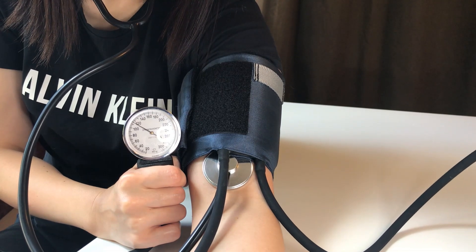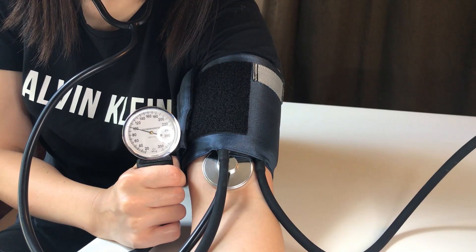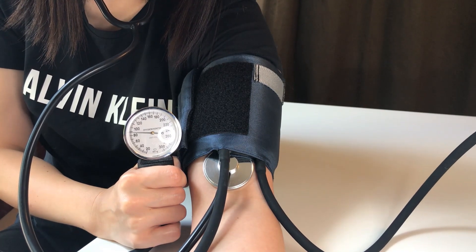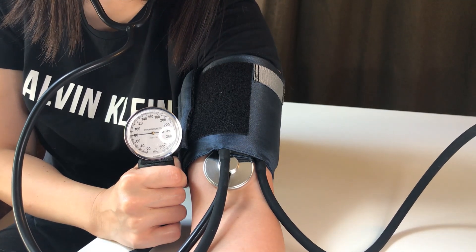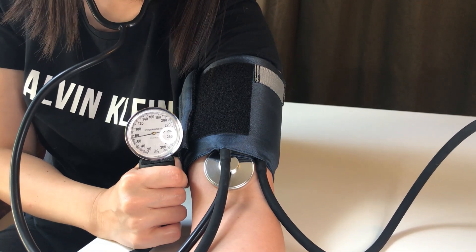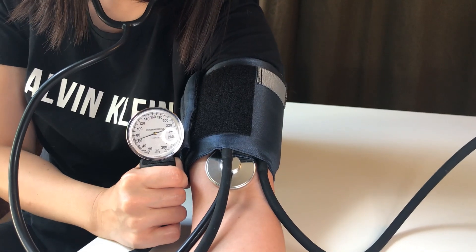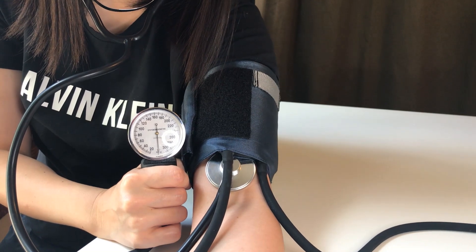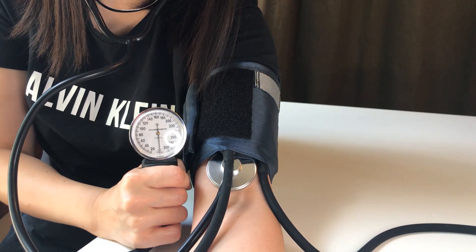Right about there — 112 or so — you can see how the dial is kind of jerking, and she can probably hear that through the stethoscope. That's going to continue down, still kind of jerking around. Let it out a little faster and it stabilizes right about there at about 70. So I'm going to let it all the way out so she doesn't have any more pain. Did you hear any noises when that was happening? Yes.